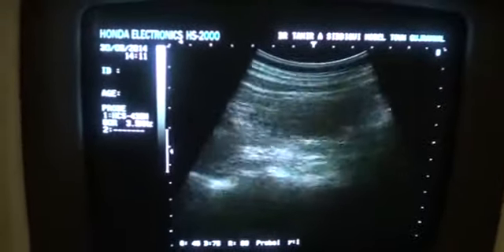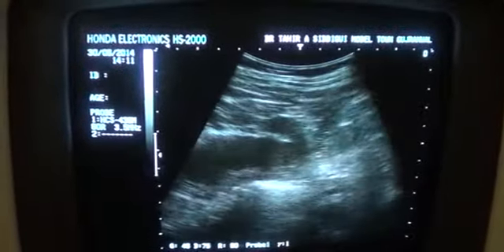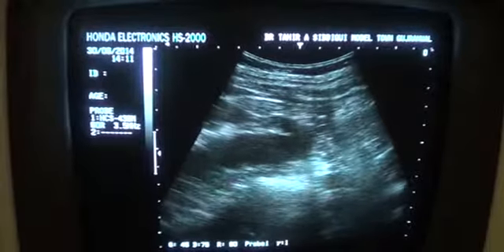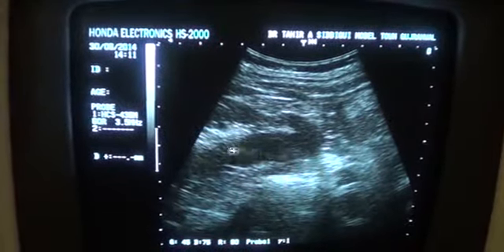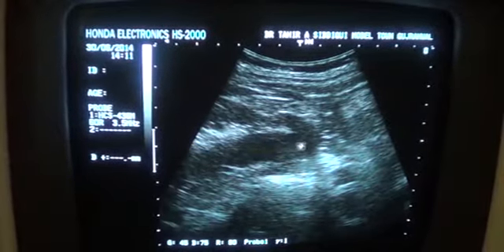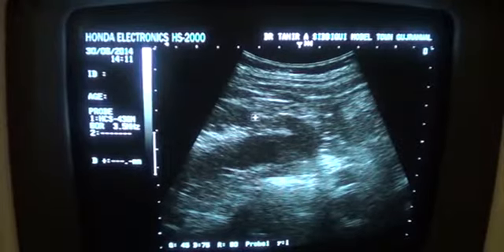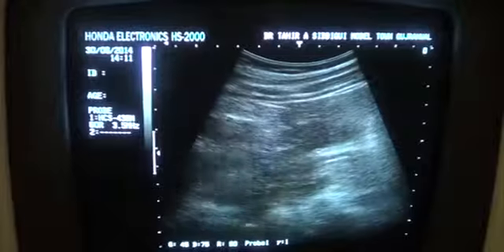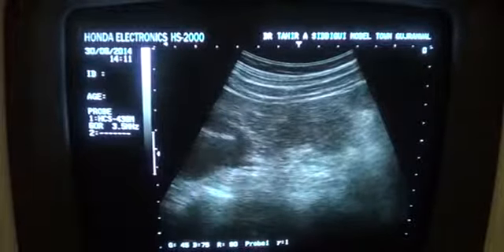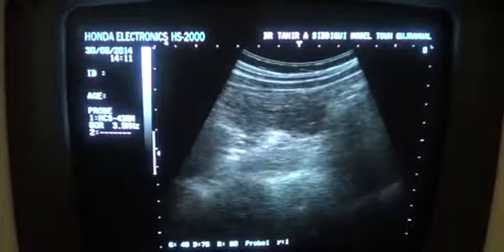Now you see that. Just a minute. This is the tubular cystic area. It narrows gradually laterally, and then it becomes continuous with another tubular structure, which is the ureter. And the ureter can be traced.